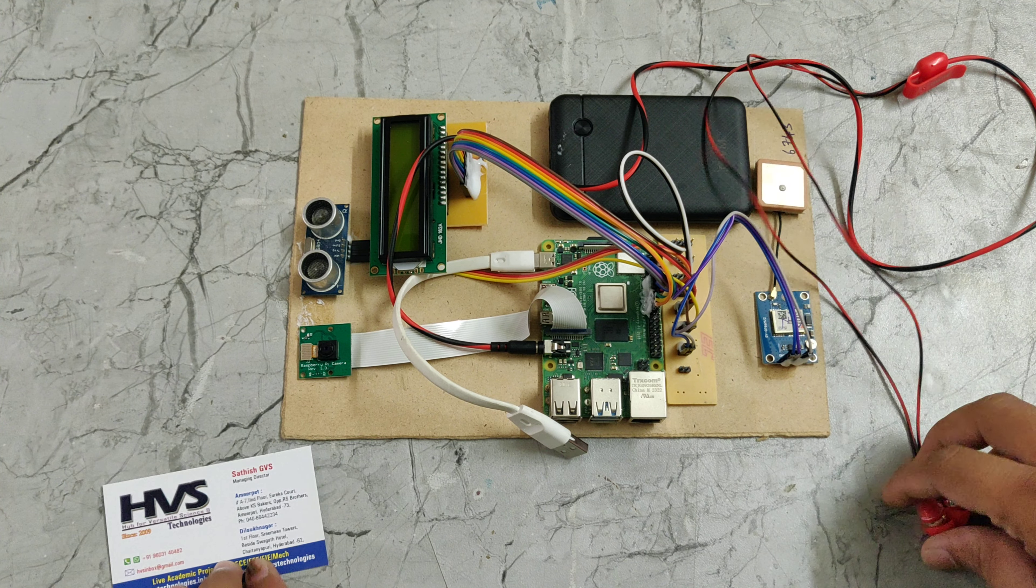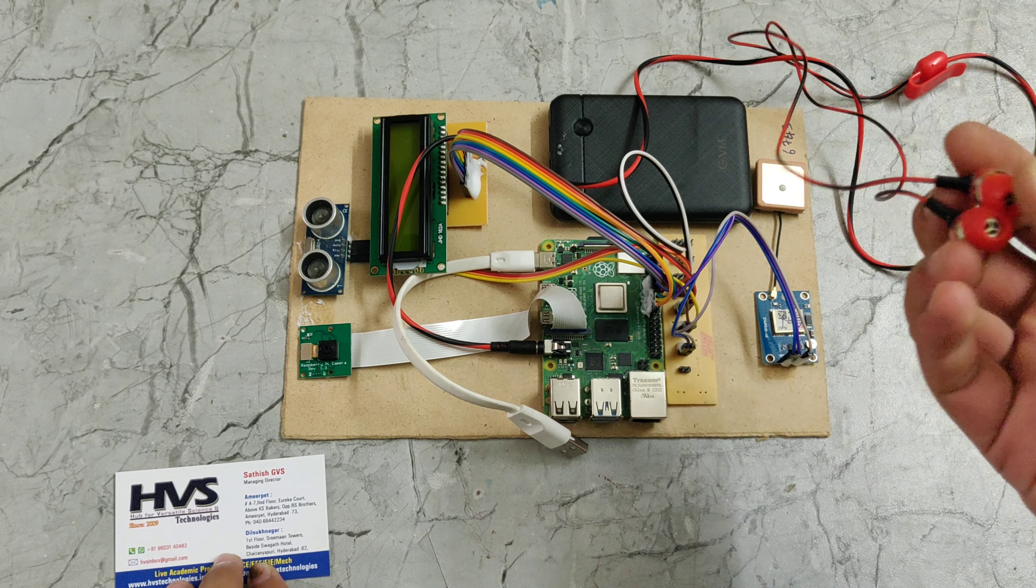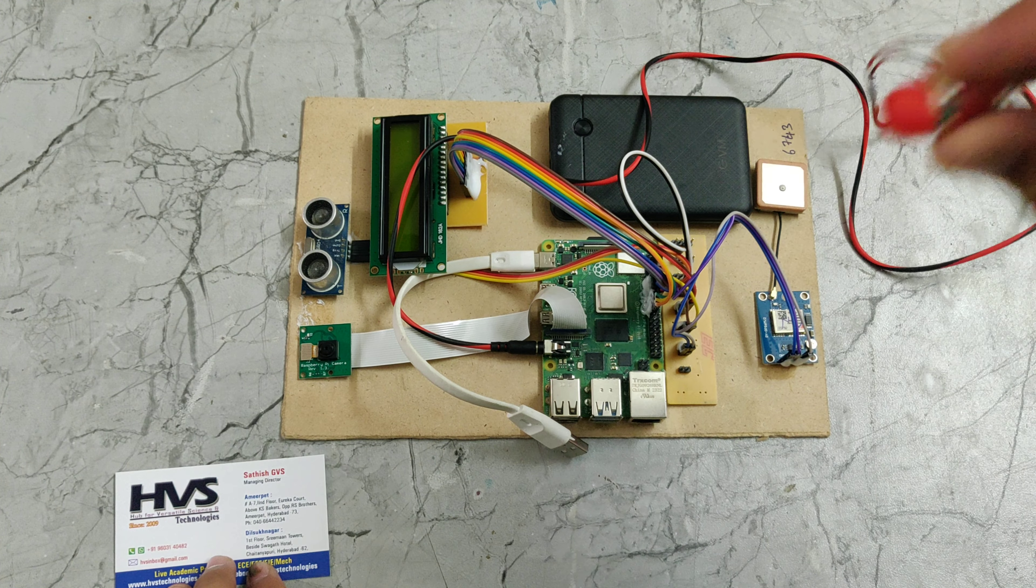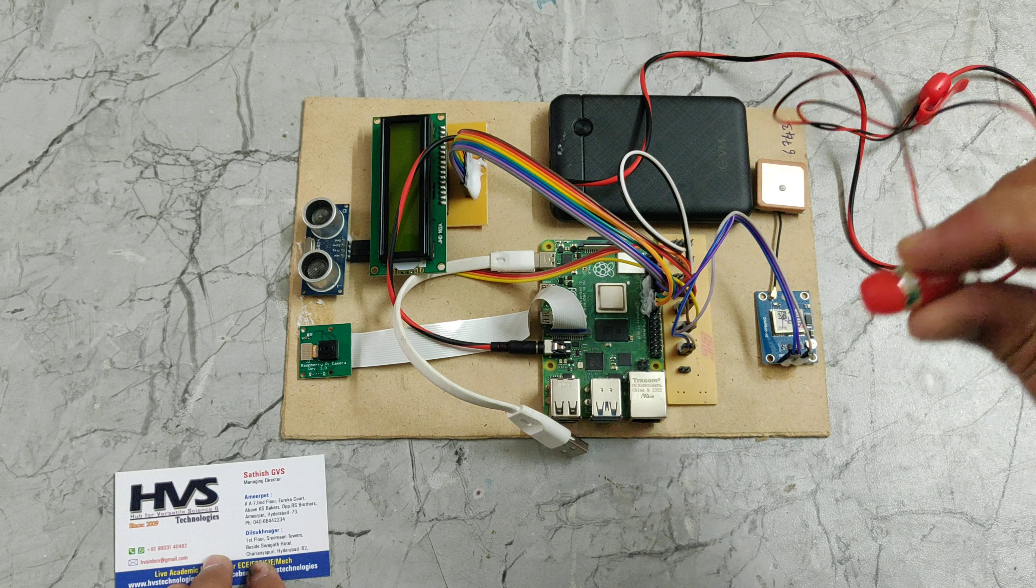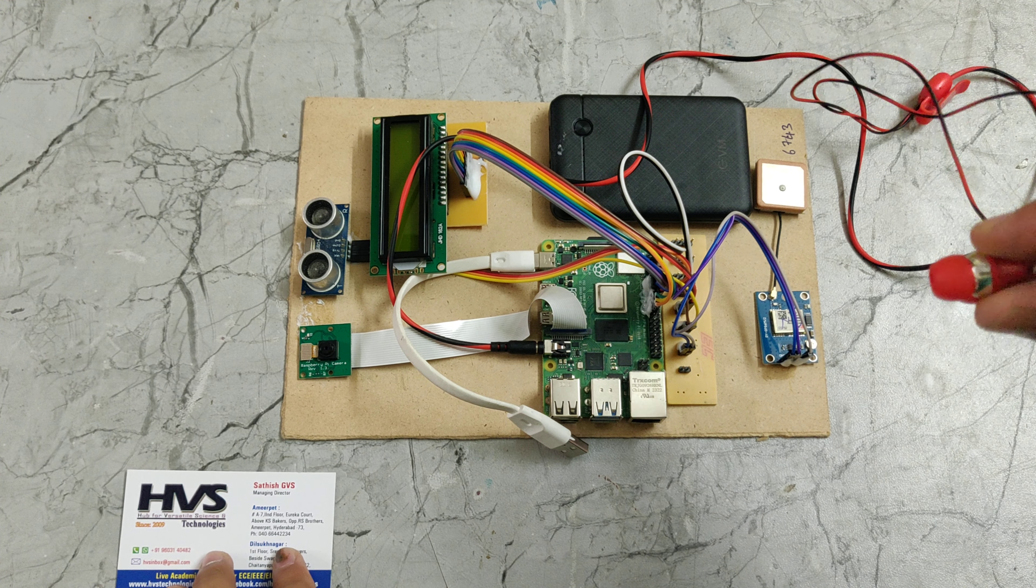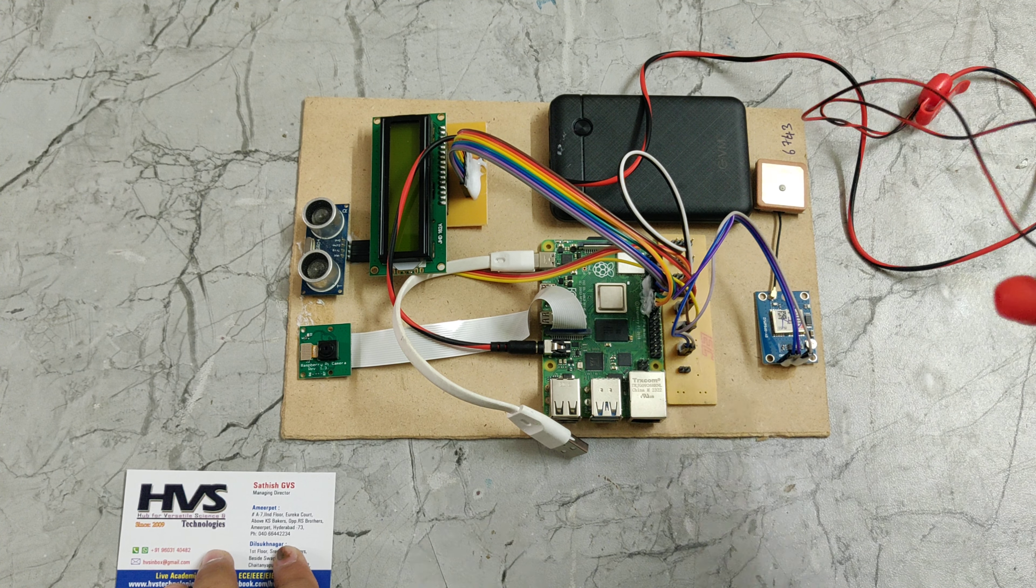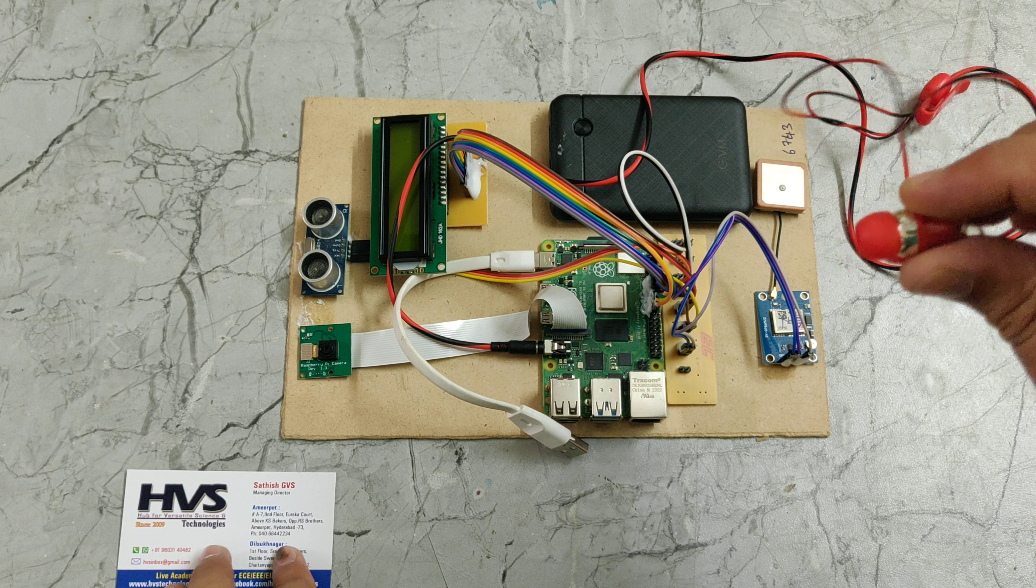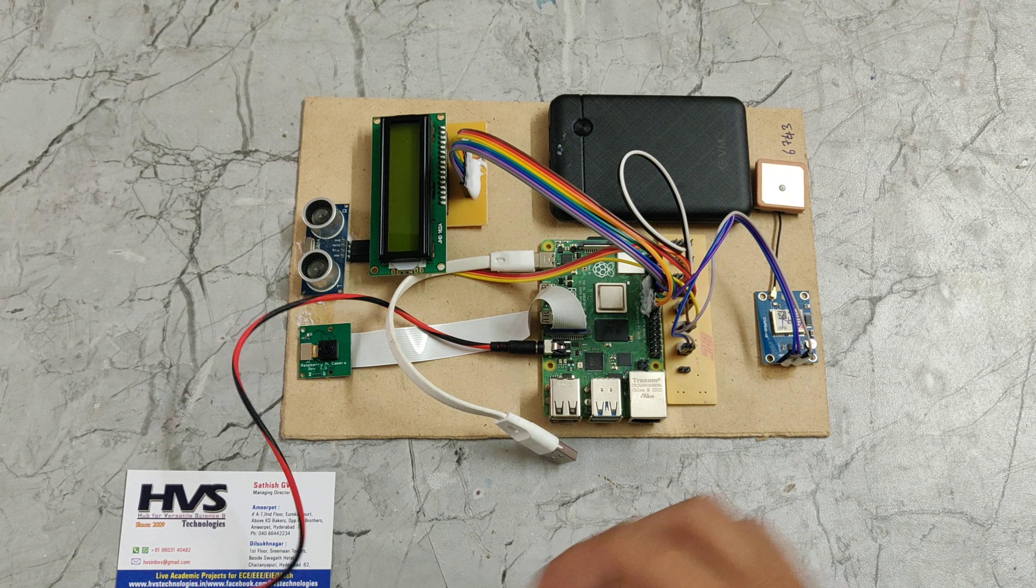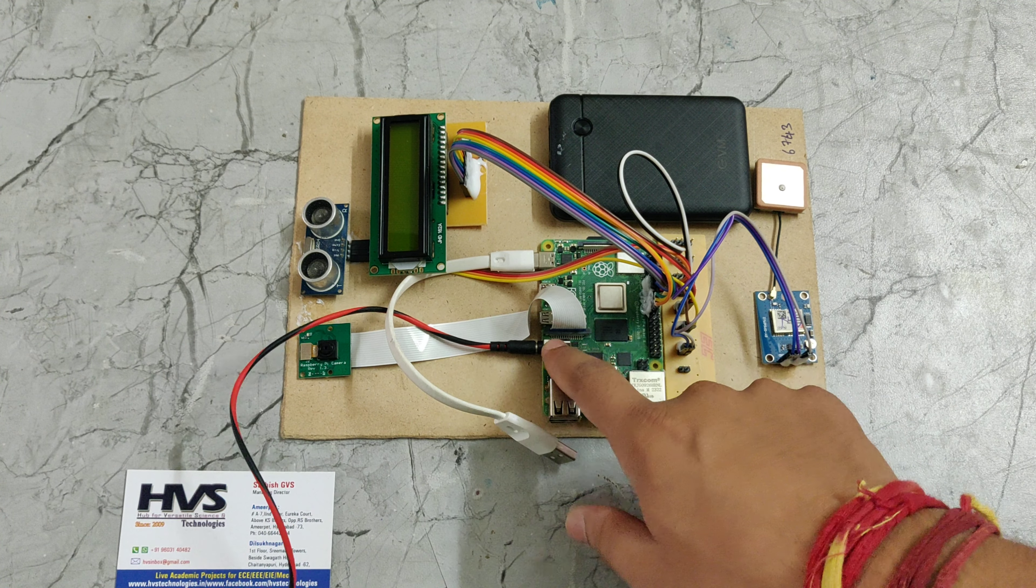These earphones will be used by that person. If any object will be detected or identified, then that object name will be given to these earphones. Here we can see these earphones will be connected to this earphone jack.